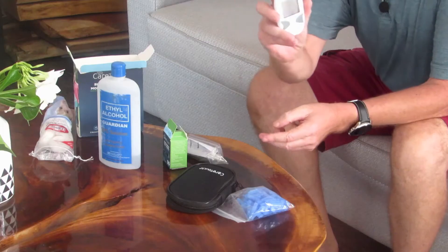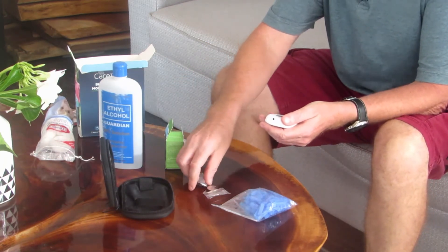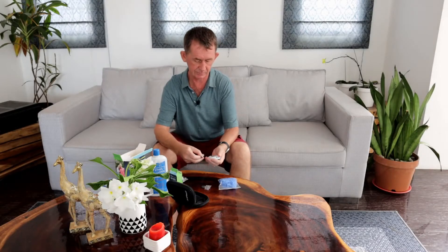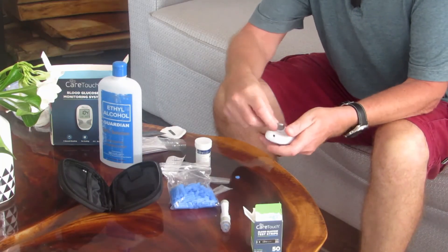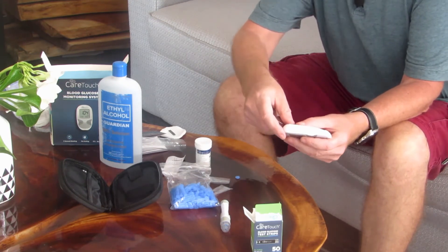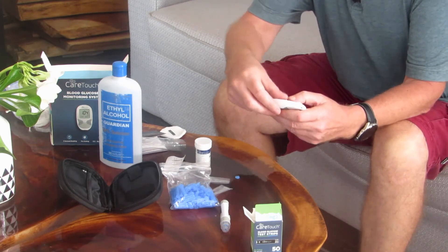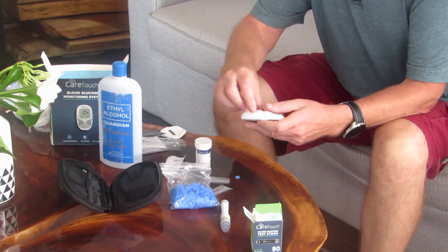The glucometer comes in this size — it's very small. It comes with two batteries, which are very easy to install. They are standard CR2032, which you can pick up in your supermarket. You open the back, put the battery with the narrower end down, push it in, and then put the cover back on.